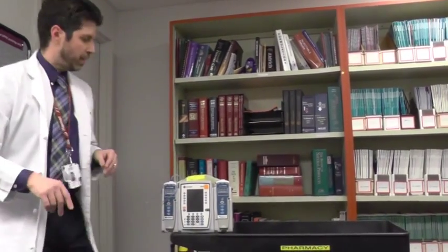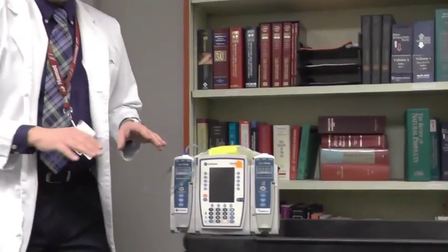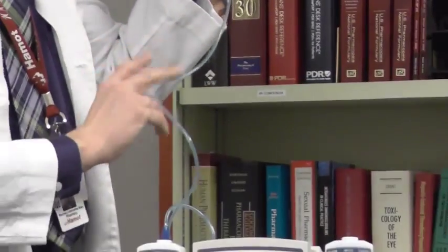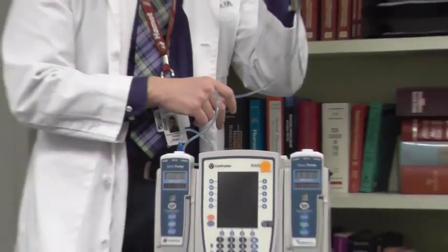Now that we have everything prepared and ready, we would run up to the emergency room. Ideally, at the same time the doctor called the pharmacy, they should have let the nurse know we have a suspected stroke patient and we're going to use TPA. At that point, the nurse should grab a pump and start setting it up. I've already spiked the bag — this is just dextrose — to attach the IV tubing and fed it through the Alaris pump. Now I'm going to show you how to program the pump so you can see the whole process of how the pump does the bolus as well as the maintenance dose.